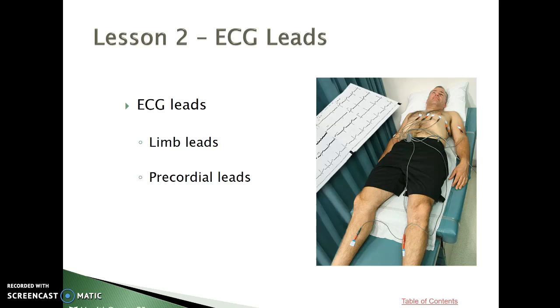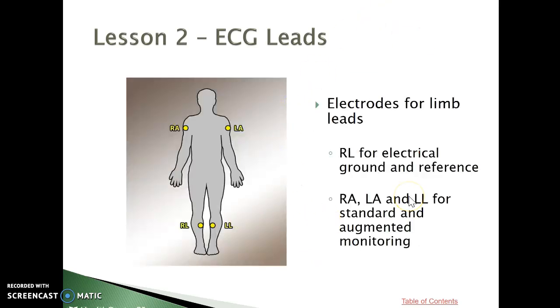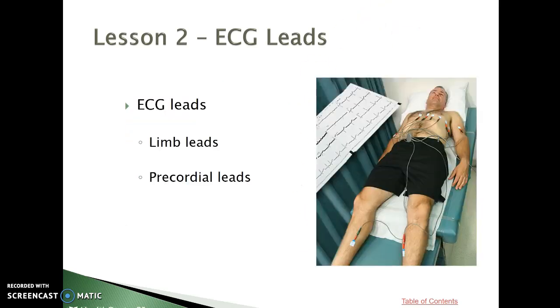Okay, so the EKG, again, like I said, I'm not going to get into all this stuff right now. The limb leads and the precordial leads. But this is what those little electrodes are, those little sticky things right there. And these are the wires that it was talking about.